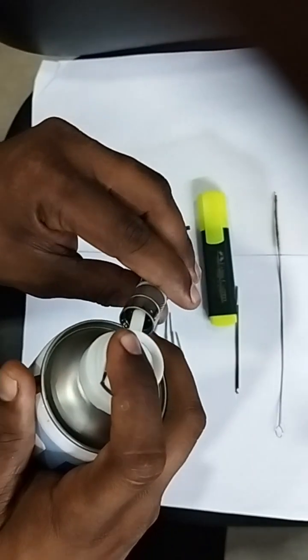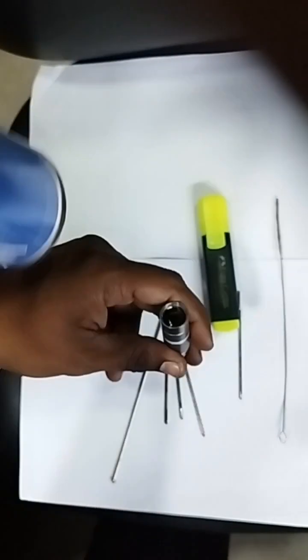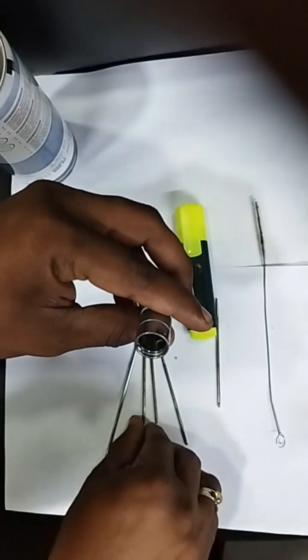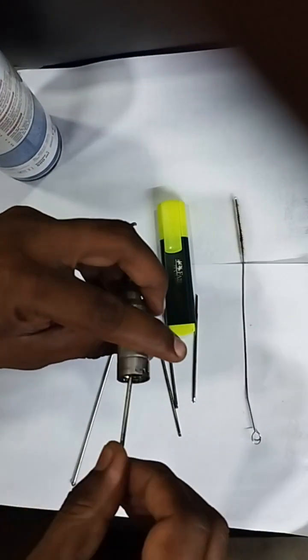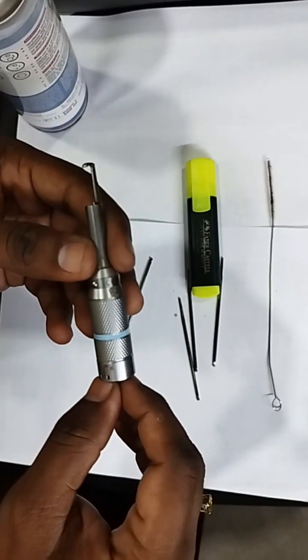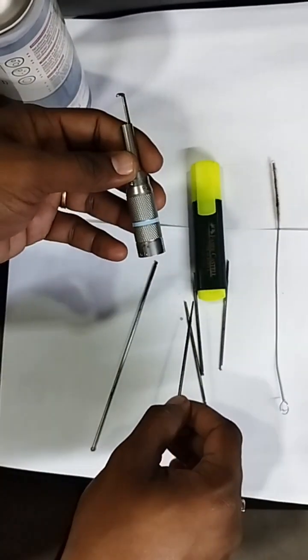Just spray a little bit here and a little bit here — that is enough. You can spray and then use it. Spraying, cleaning, and all maintenance you have to do post-surgery. Don't do it during surgery or before surgery.